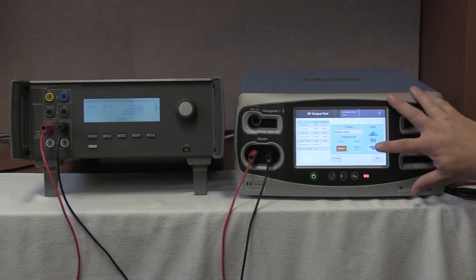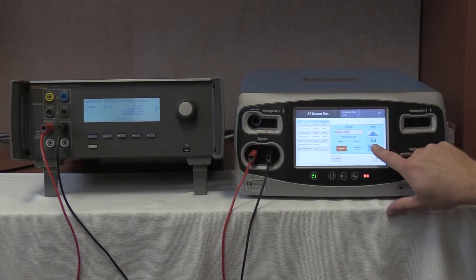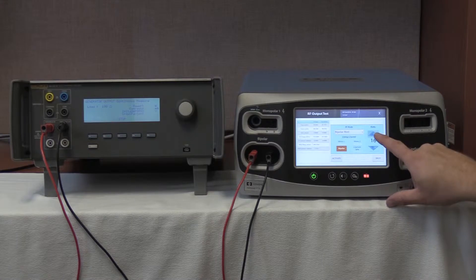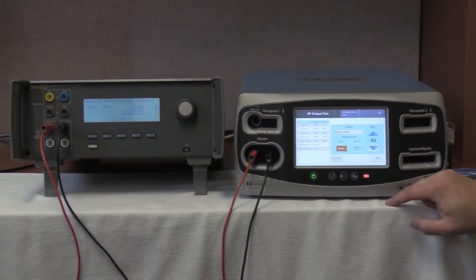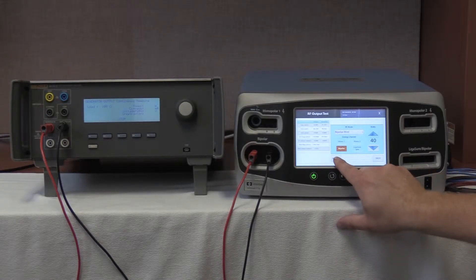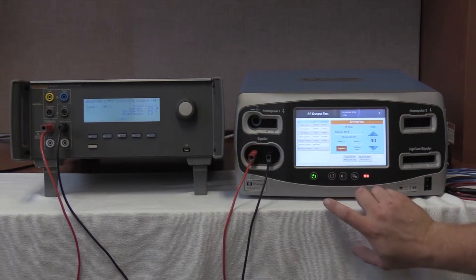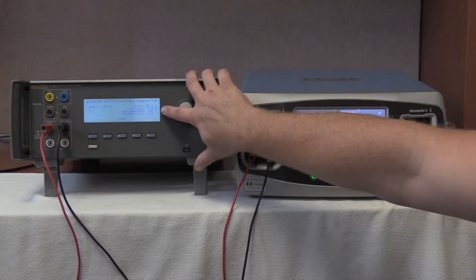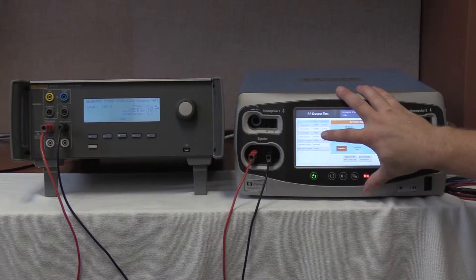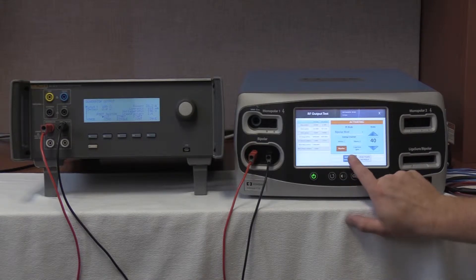We are now going to select 40 watts by pushing the down arrow, and it would like us to do bipolar medium. We are going to push up to get to 40 watts. Once 40 watts is selected, press activate — the QES3 is still running. Our range is 547 to 735 milliamps. We are reading 618 milliamps with an output of 626.5 milliamps, while within specification. Deactivate and hold the values on the FT10.